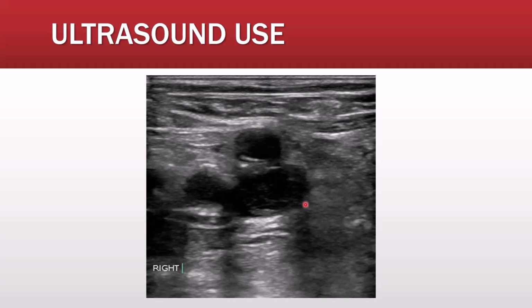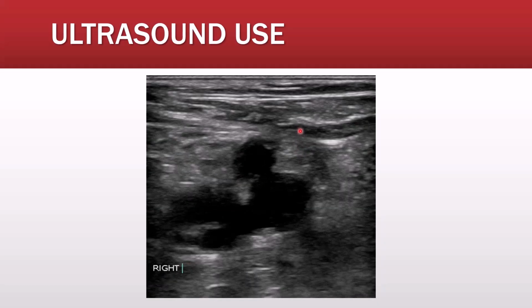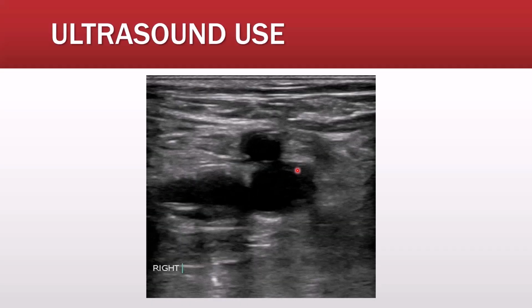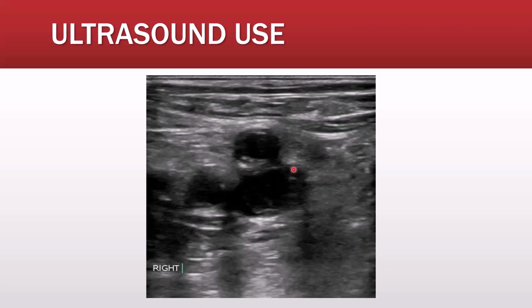Now let's point out some other issues that we're seeing with this ultrasound that can assist us. The operator right now is doing a compression test. You can see the downward dimpling of the artery right now, but most importantly, in the venous structure, it is not collapsing. This is a large DVT.